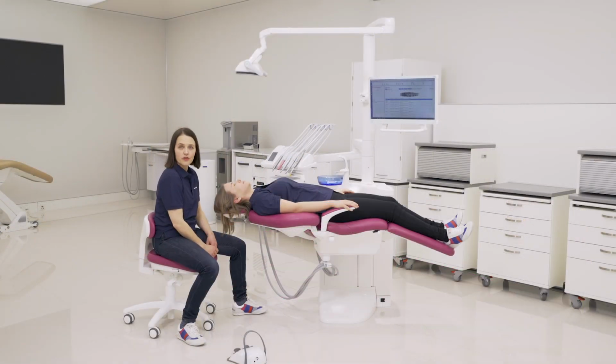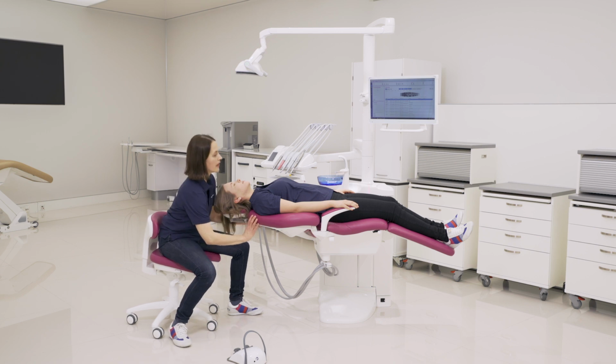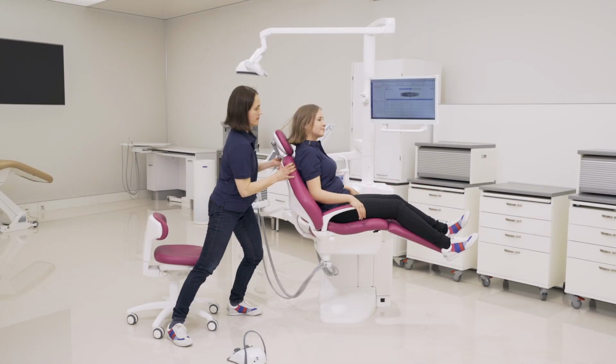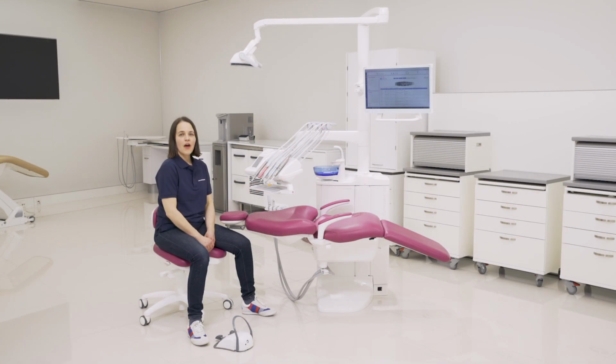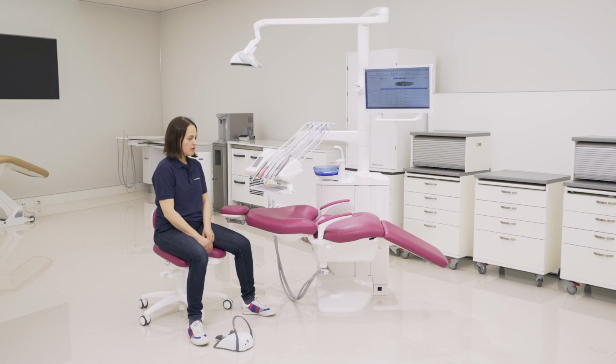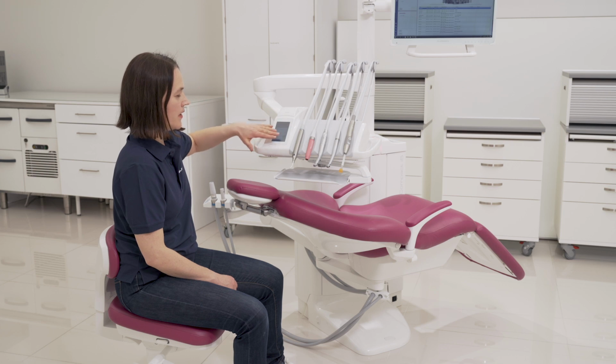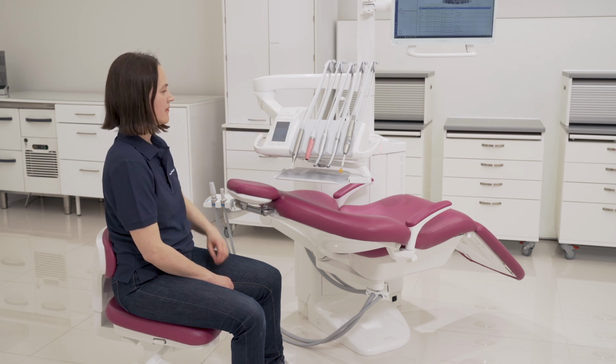In case of emergency, you can get the patient up quickly by manually pushing the backrest up. For whatever reason you have to stop the chair movements, you can do it by pressing any of the foot control buttons or by pressing anywhere in the user interface.